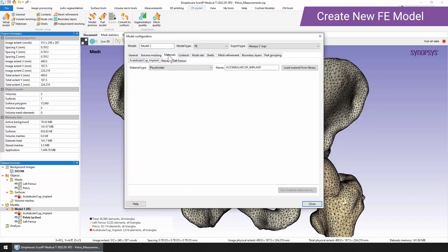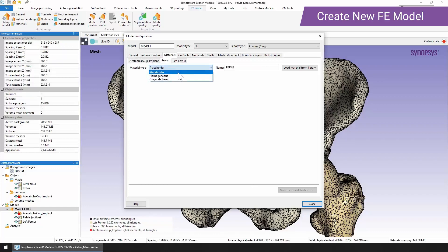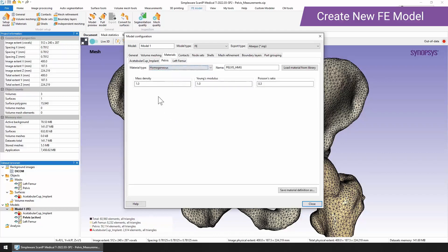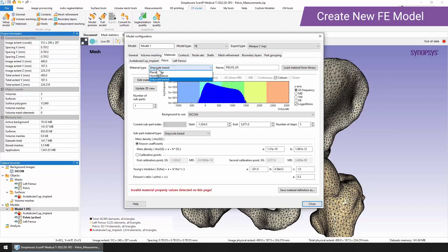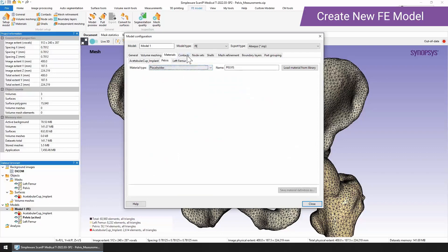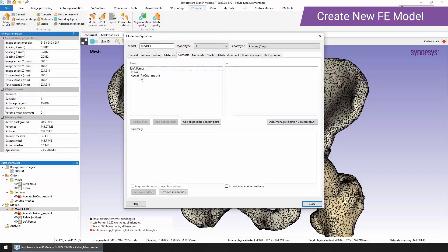When it comes to materials, we've got a few options here as well. We can use a placeholder for the material, so when it's output into maybe a simulation package, you can then assign a material with its material properties. You can use homogeneous properties and just enter them directly. Or you can use a grayscale based approach. This is where you use a calibrated CT scan to understand the relationship between the material properties of the bone or whatever it is that you've scanned and the grayscale value that's in the image data. As long as that's been calibrated, then you can bring those material properties through into your model.